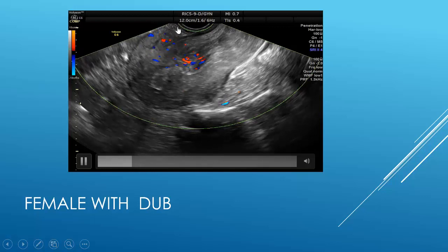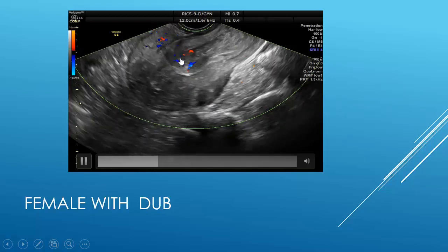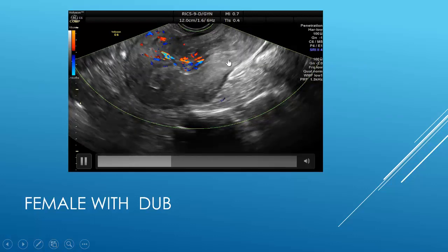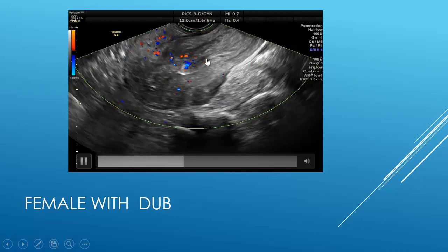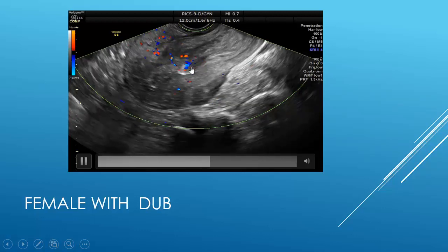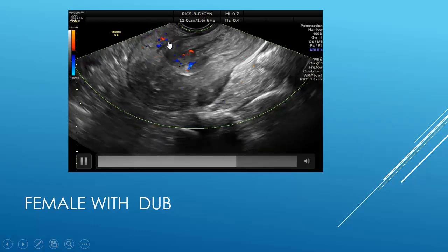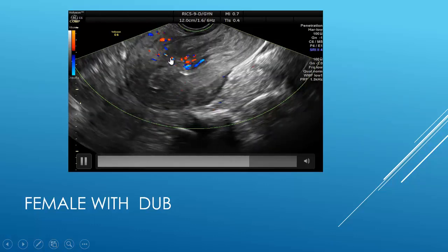What is this? This is the uterus by transvaginal ultrasound, and there is an intracavitary mass. This is a totally intracavitary mass. It is isoechoic to the myometrium, showing high vascularity but no vascular pedicle sign. It is a perifibroid plexus of vessels.